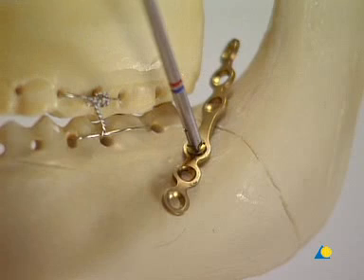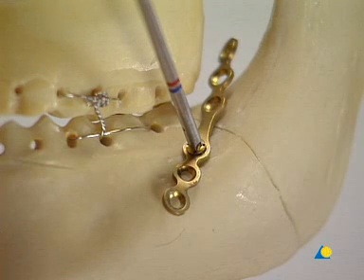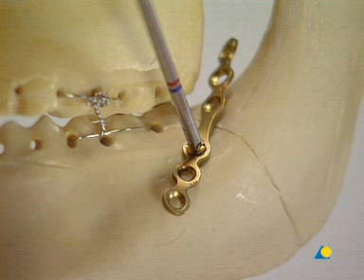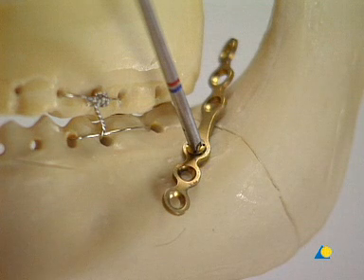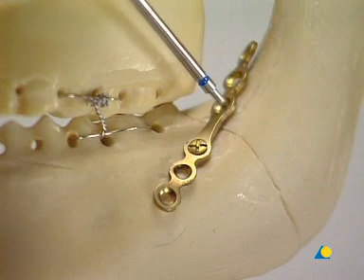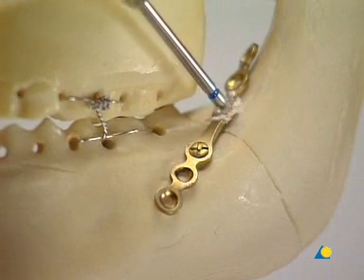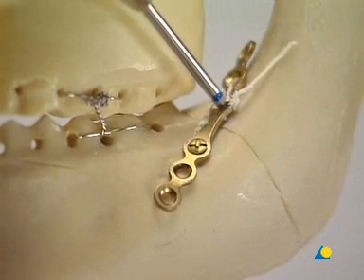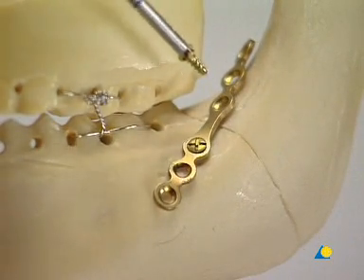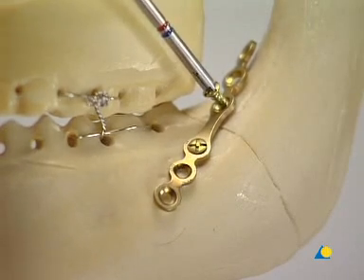It is also possible to place the first screw into the proximal fragment to reduce the condyle-bearing fragment with the help of the plate. Another hole is drilled on the other side of the fracture, and another 6 mm long, 2 mm screw is inserted.